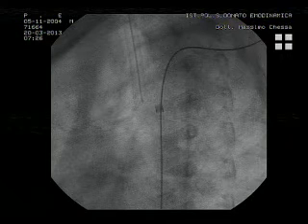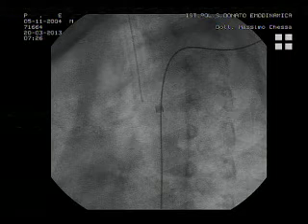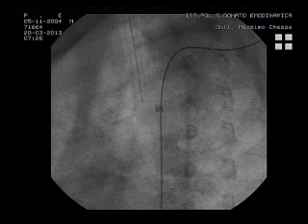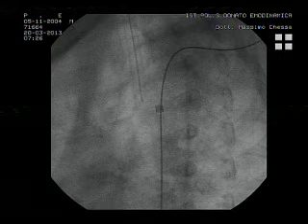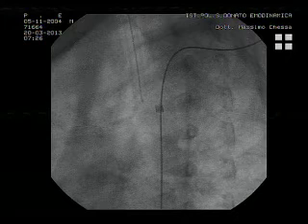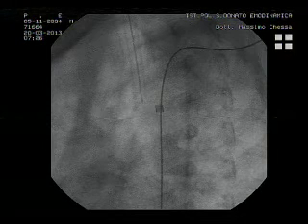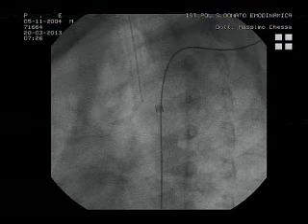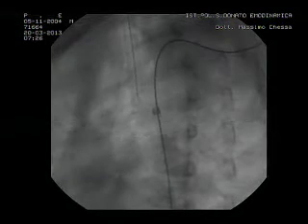Massimo, before we know the results of this, we're going to ask the audience to raise their hands. How many of you would perform balloon angioplasty at the start? How many of you would use a bare metal stent? Raise your hand. And how many of you would use a covered stent? The far majority chose the covered stent. They agree with you. The majority, yeah.